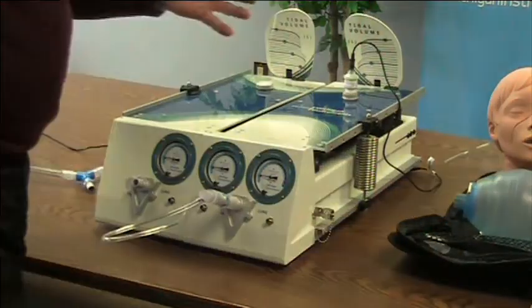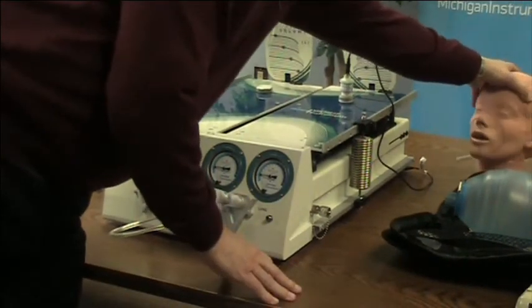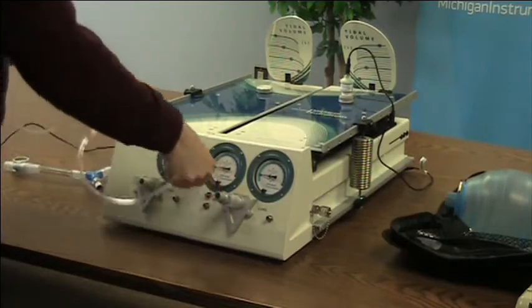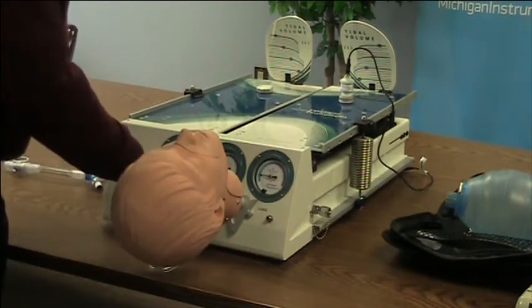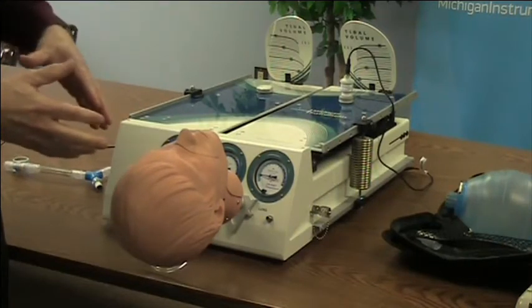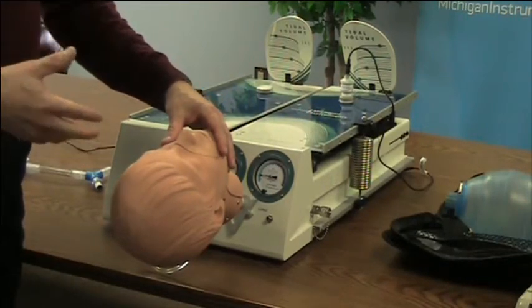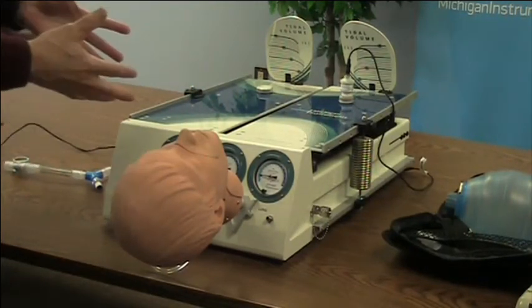One of the ways you can expand on the simulations you're doing with this system is to add a head to the simulation. We offer our HSM head simulation modules, which again have that same standard 15 millimeter connector. Now you have a head that allows you to ventilate this test lung using any kind of non-invasive ventilator, bag valve mask, and lots of options that just expand the potential use of the TTL.